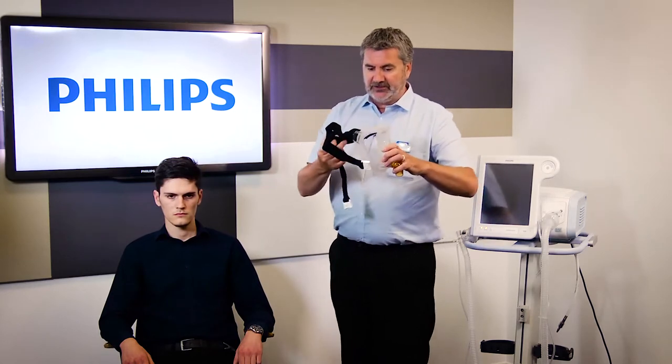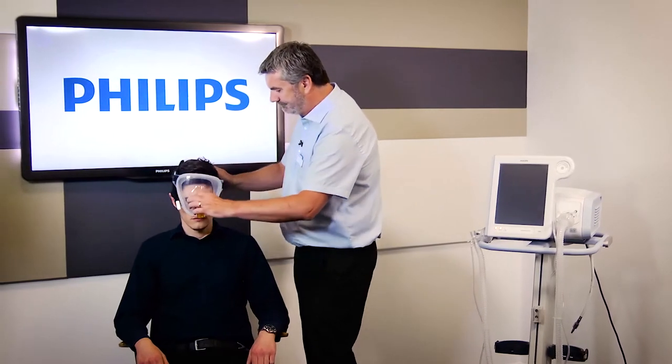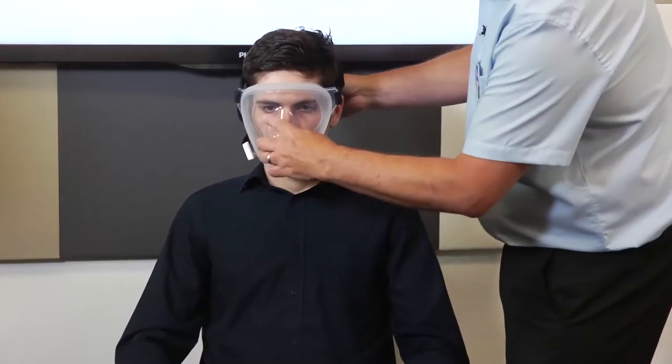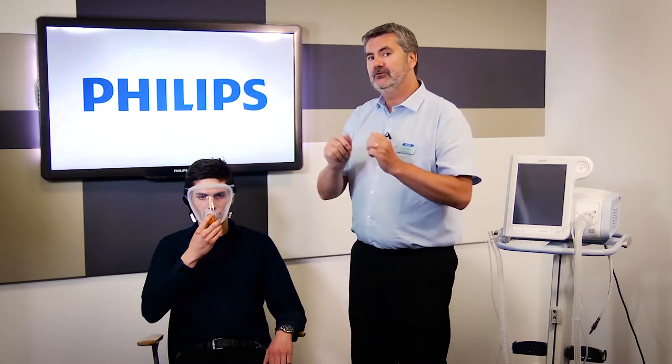I've measured up and I'm going to place this over my patient's face, nicely in position. I'm going to ask my patient to hold his mask at this point. Ideally, it would be better to have two clinicians doing this — nurse, physio, whoever. If you are using two people, one person just holds the mask. Try to resist helping with the tying. So one just holds the mask in position, the other one does the tying.